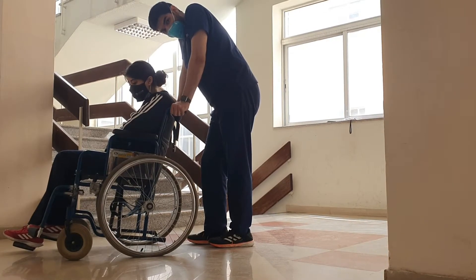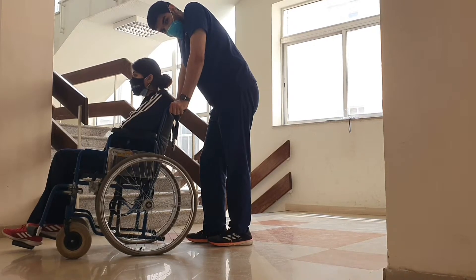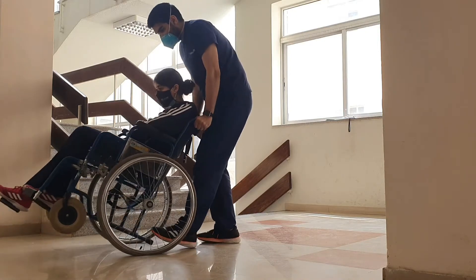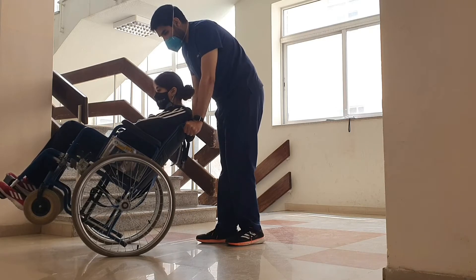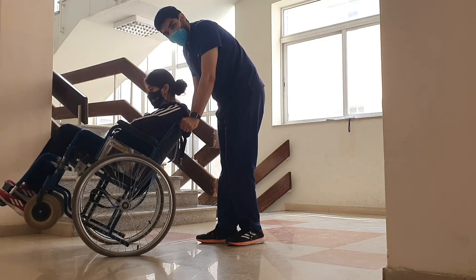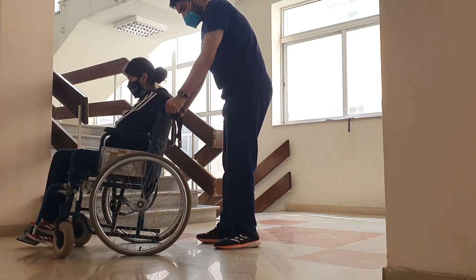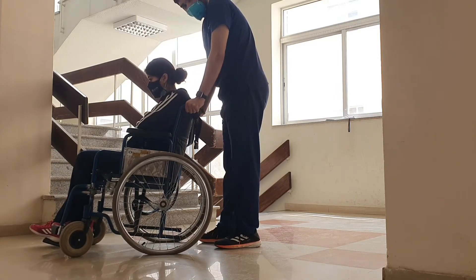An important skill that a person in a wheelchair needs to practice and hopefully master is the wheelie. The wheelie involves lifting the small wheels — the casters — off the ground. This skill is very important for maneuvering around small curbs or obstacles. The patient needs to be able to do it actively, and there is no single optimal description for it.